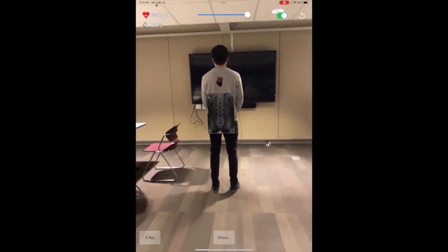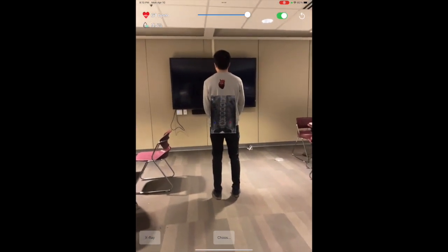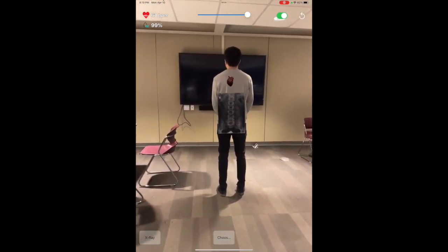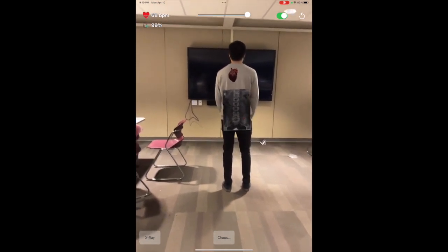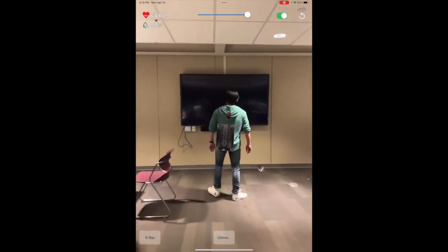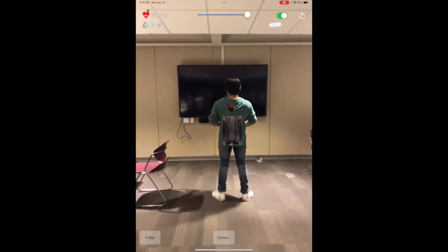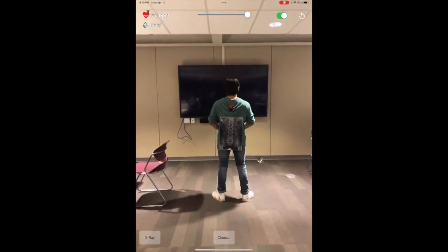This feature is particularly useful for medical professionals who want to explain spinal conditions to their patients. As well, our app works with anyone, regardless of body type or any other differences. As we can see, the app is also able to display the heart of this person, as well as the X-ray image. Everything is scaled to the dimension of the user being scanned.